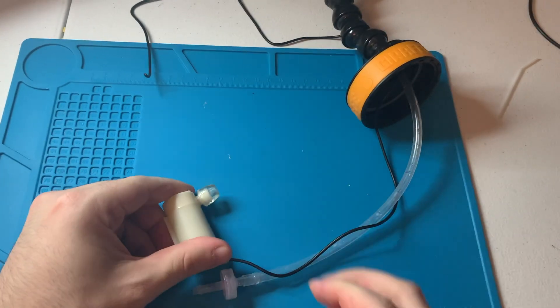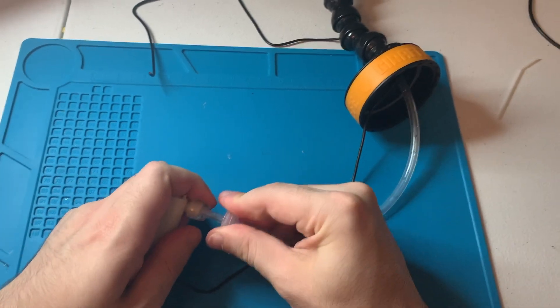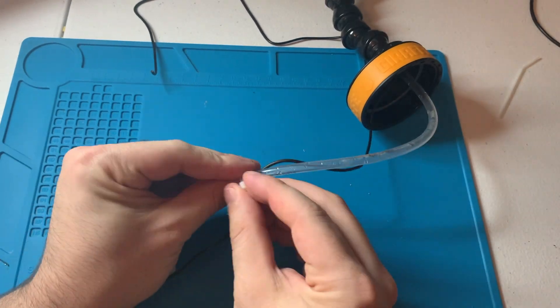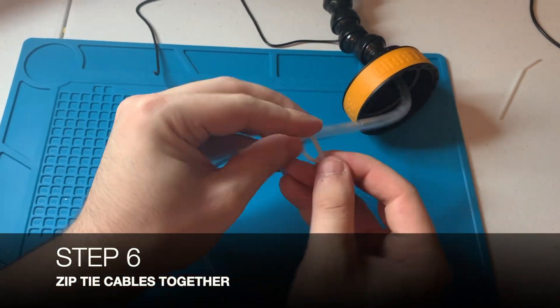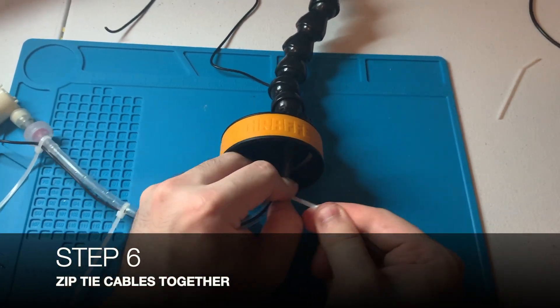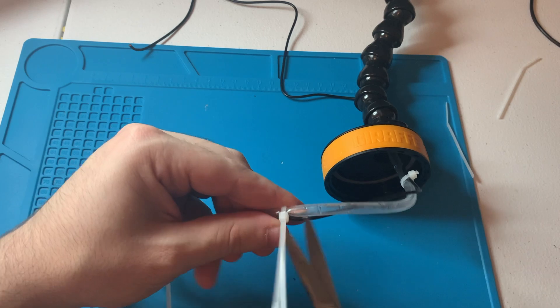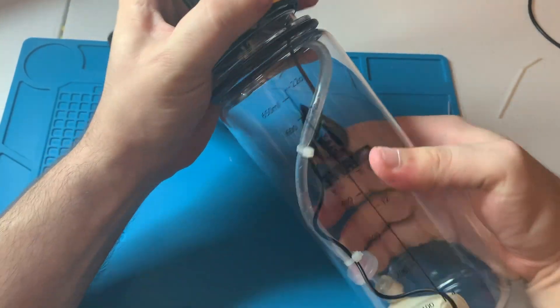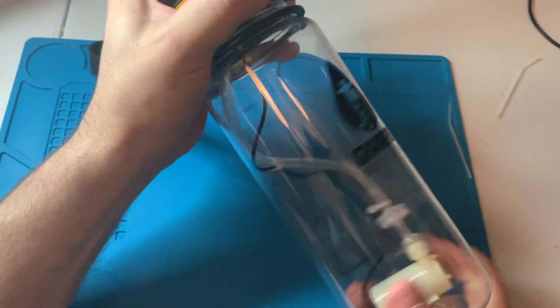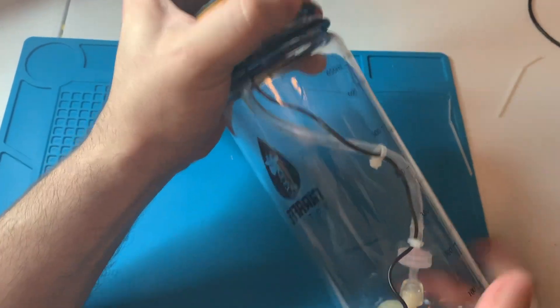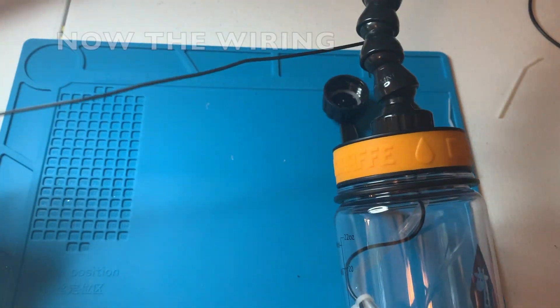Once that's done, we'll add three zip ties to secure the wire to this tube. Then we can screw the top on, and most of this is already done. Now we've got to work on our wiring.